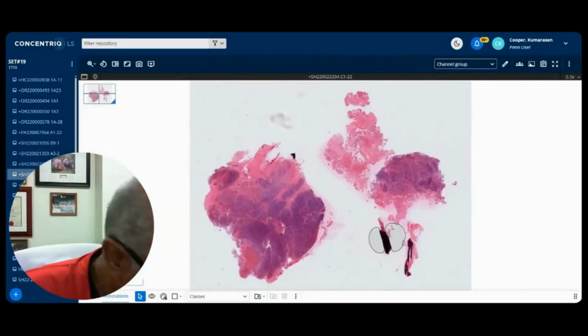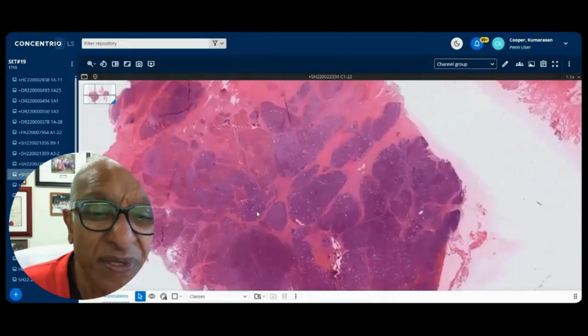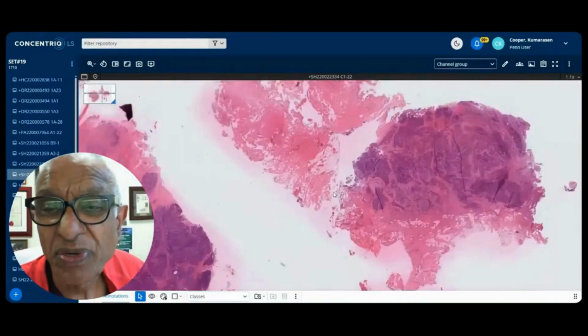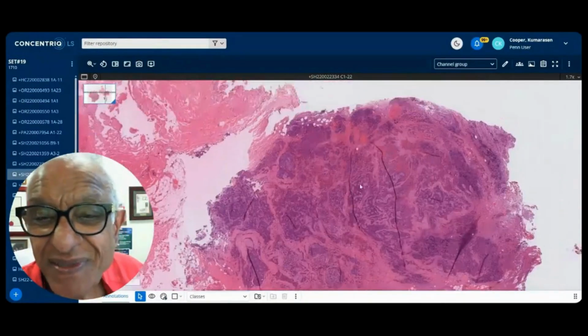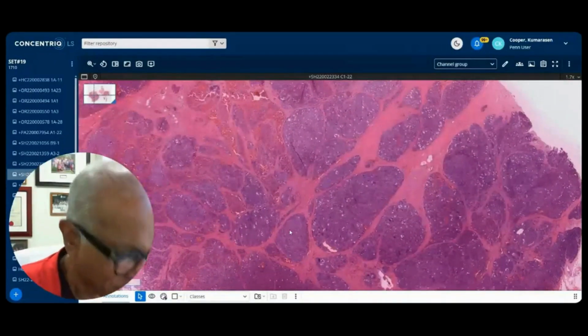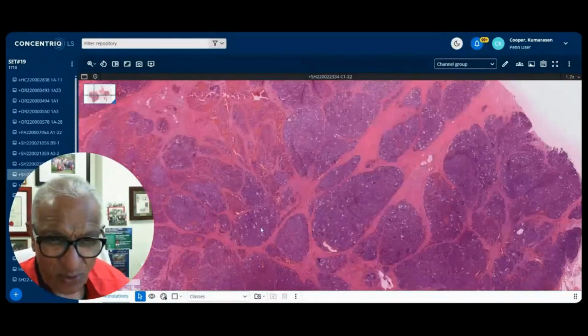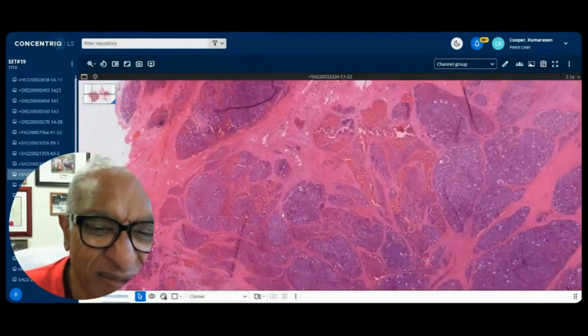Yeah, here we go. 22334. So this is a parotid mass, and they call this a biopsy. Okay, that's all tumor. I don't think I've got normal parotid gland here, but this is all tumor. Okay, the section's a little thick and did not scan very well. These were older scans from my collection, which I started on this conference, but the more recent scans look better.